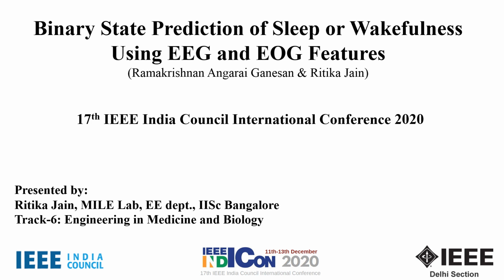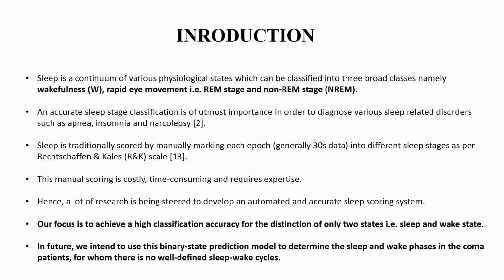My presentation is on binary state prediction of sleep or wakefulness using EEG and EOG features. Now, sleep is not defined discretely, rather a continuum of various physiological states. Three broad classes are wakefulness, REM, that stands for rapid eye movement, and non-REM, that is non-rapid eye movement. Our focus in this work is to achieve a high classification accuracy for the distinction of only two states, that is sleep and wake state.